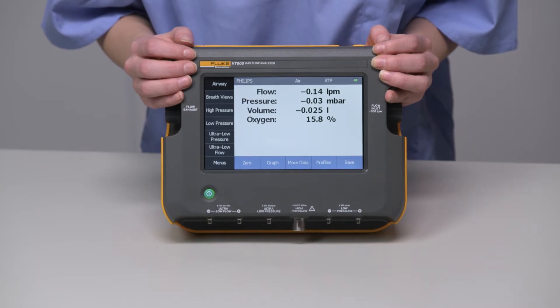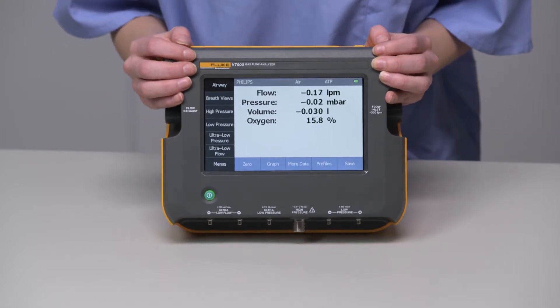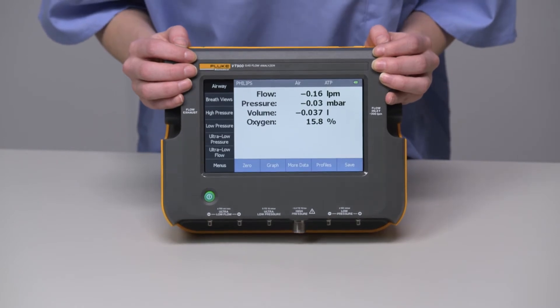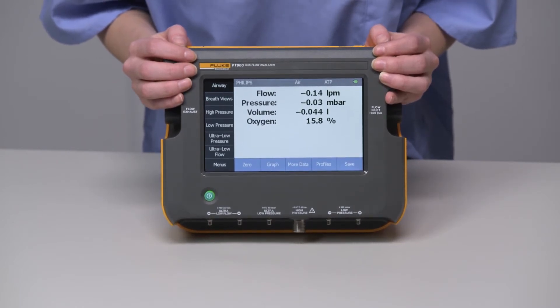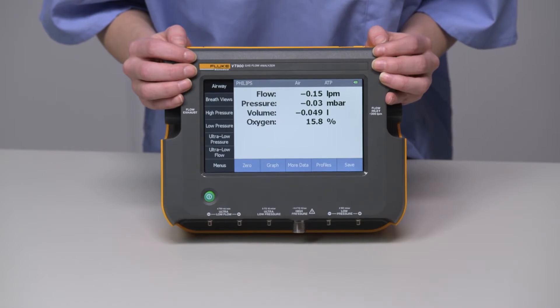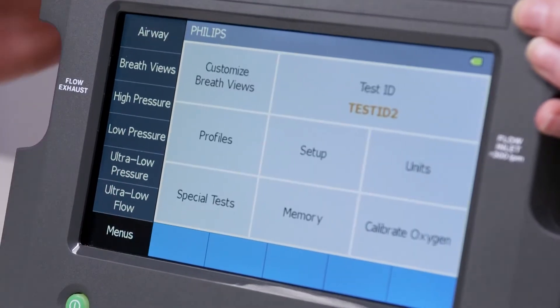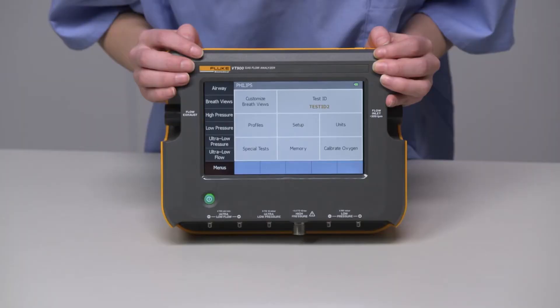Before we dive into what's on this screen, let's talk about where to find or change features on the device, because the first thing you're going to want to do is set your device up for testing. Press the Menus option on the bottom left of the screen.